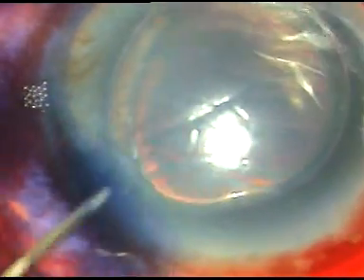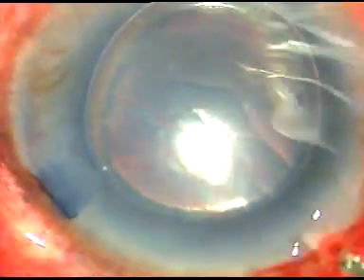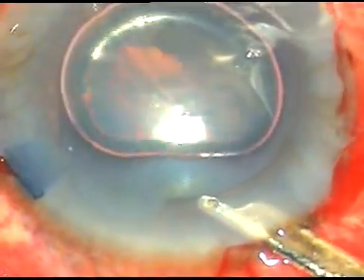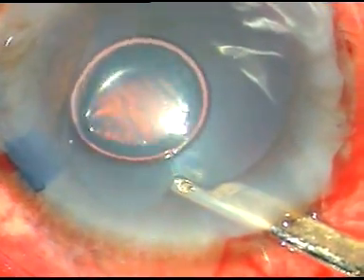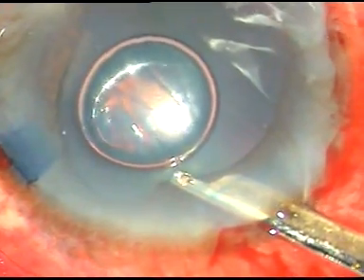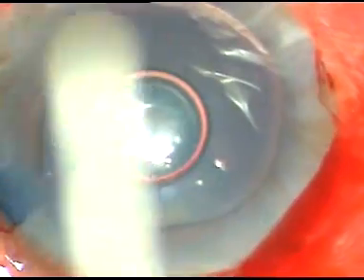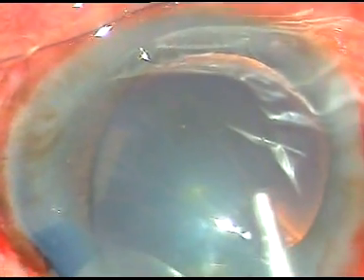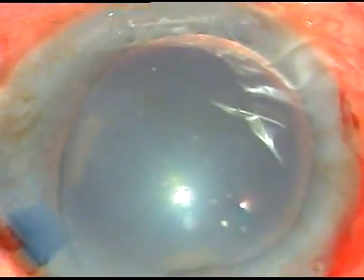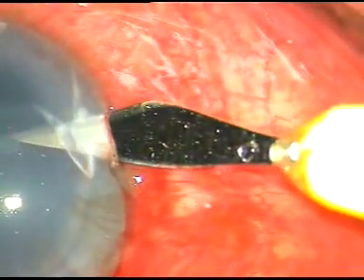quite well, quite intensely. In cataracts, I don't use dye so long. Now I wash the dye out. The anterior chamber is very shallow, so I don't go into the anterior chamber. I remain at the incision, near the incision, and wash the dye out. Now I inject viscoelastic substance. Now the side port on the right side was very small, so I enlarge it a bit.